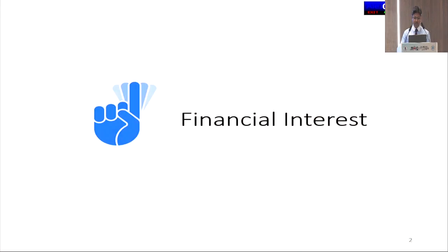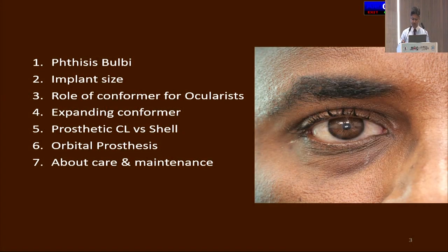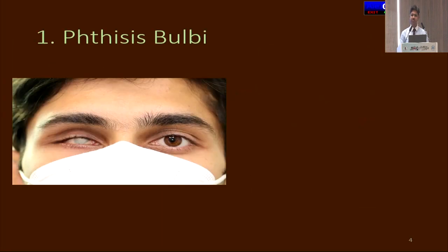The finishing touch. I have no financial interest from this presentation. I will be covering these topics based on the indication for ocular prosthesis. The first indication is phthisis bulbi.